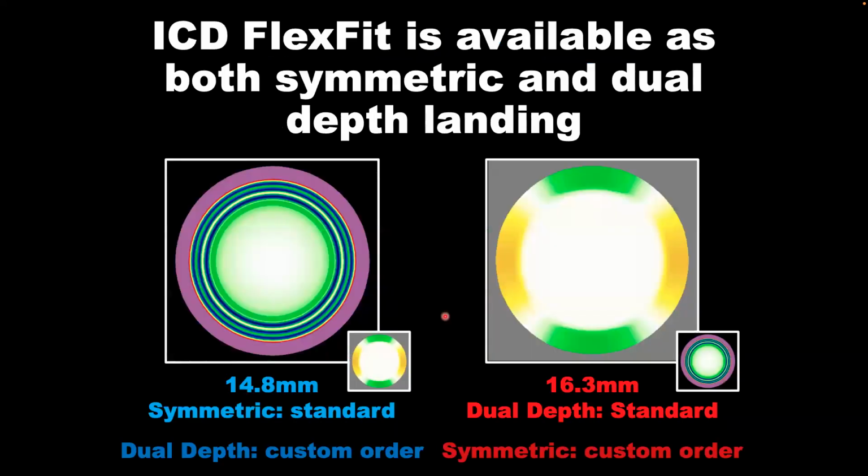You can always ask for the 14.8 to have toricity, and it comes symmetric, but you can ask for toricity if you need it. Let's think that you are seeing edge lift and you are getting dye ingress on opposing quadrants, then you may request to have toricity. It's less common for sure, but it's not uncommon to ask for it.